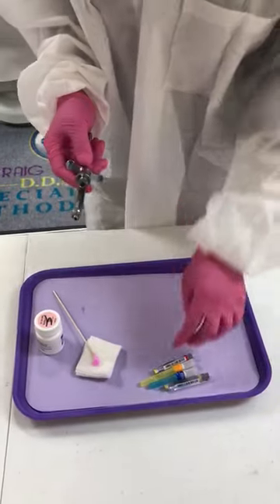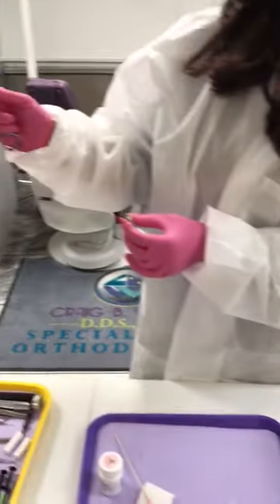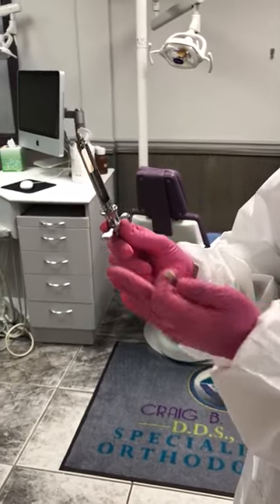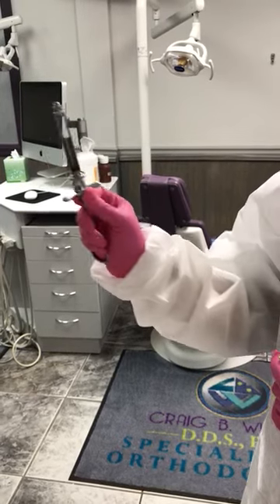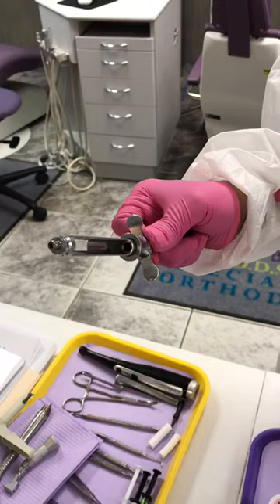Now let's load up the syringe. We're going to take the syringe and the anesthesia. See how it's placed in my hand — I have my thumb here and my remaining fingers here. My thumb is pushing it up so the anesthesia can drop down in there.